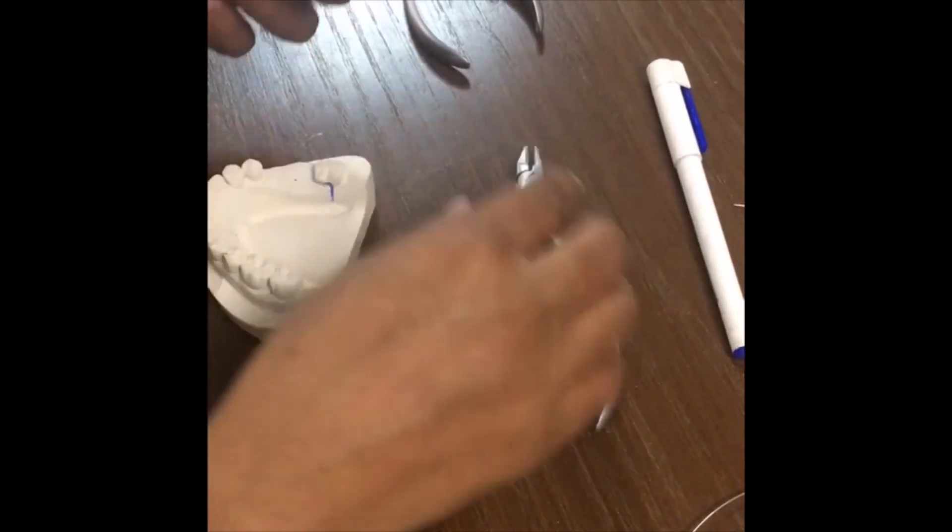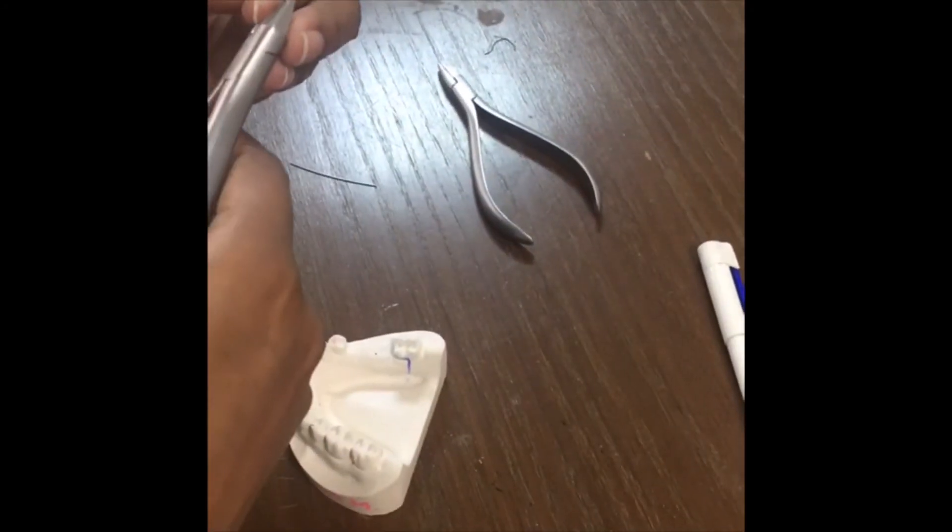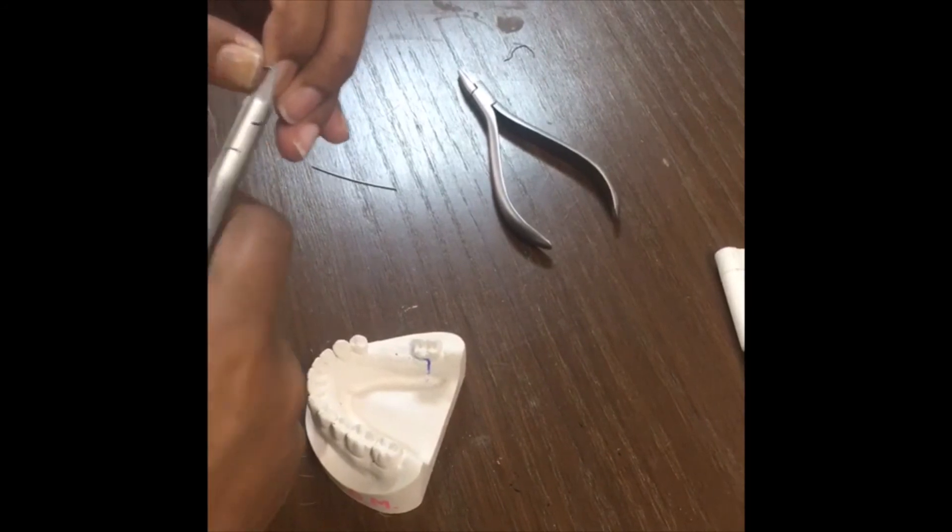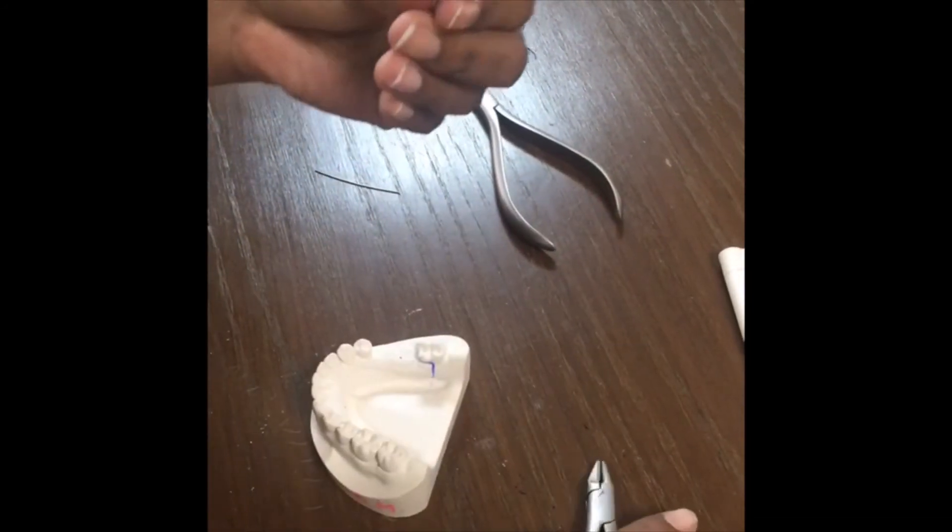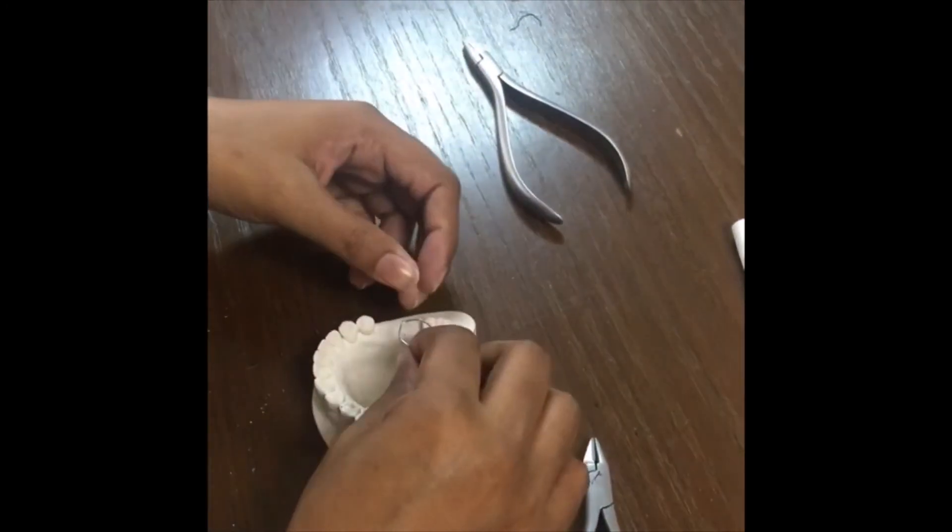And then last but not the least you have to turn the wire in the end a little bit at a right angle to the minor connector so that you can create the retentive tag.